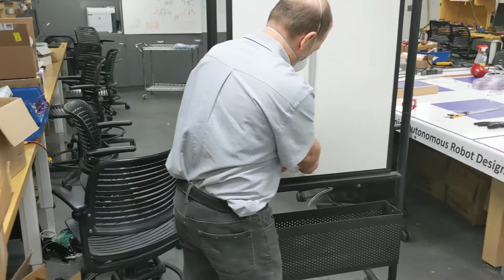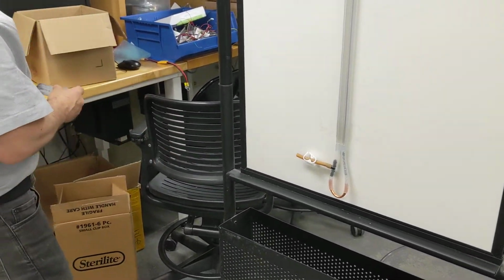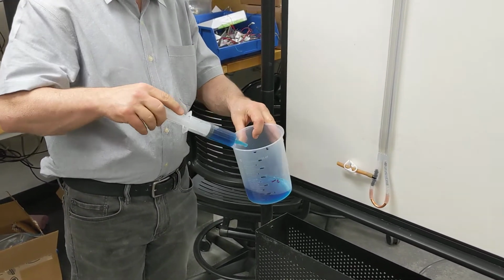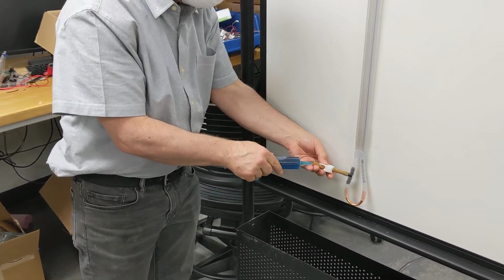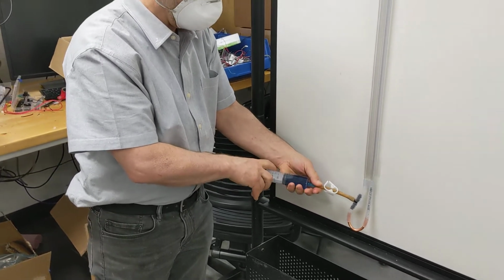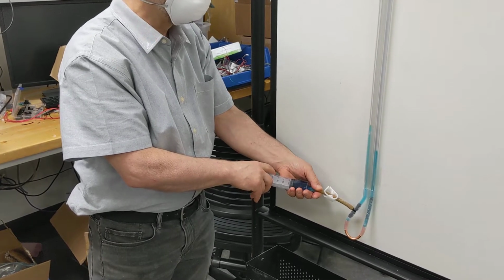So this one is here just for the purpose of filling from the bottom to avoid bubbles. There's some blue, lightly salted water, which we're going to fill it with. And we probably want to fill it about halfway up because we need plenty of range for pressure. So I'm filling it slowly to avoid bubbles.